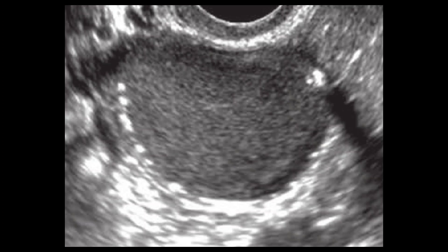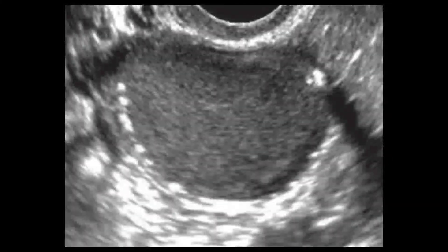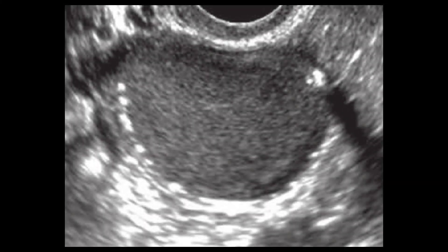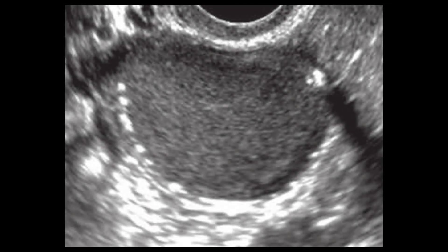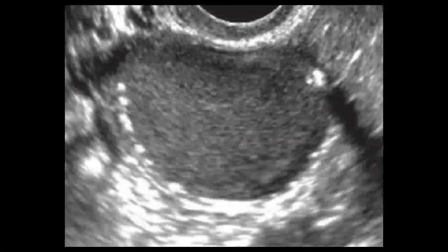This is a transvaginal scan. You can appreciate a well-defined cystic lesion showing low-level internal echoes. One thing worth noting is the small typical peripheral echogenic foci — that is a characteristic feature of endometriosis. Here you will see multiple spectra of the appearances of endometriosis.